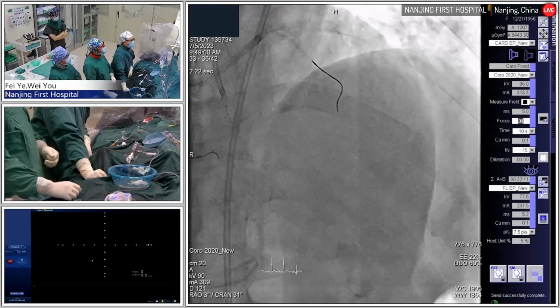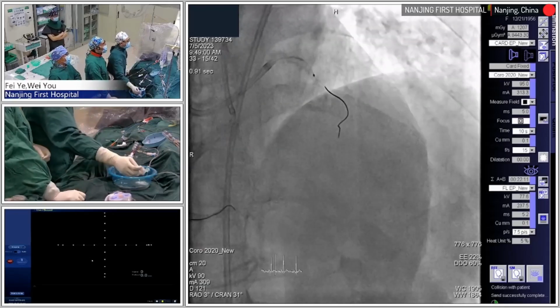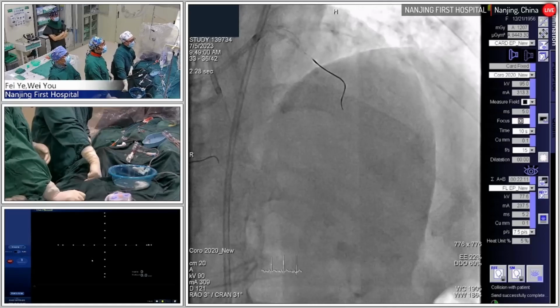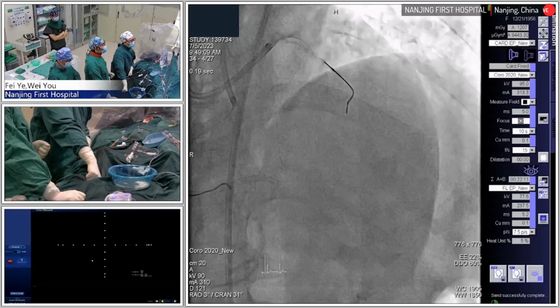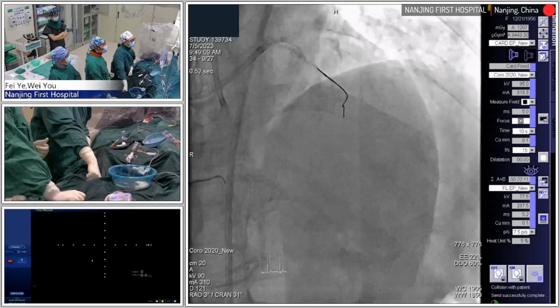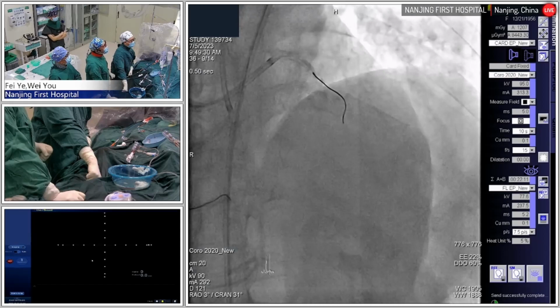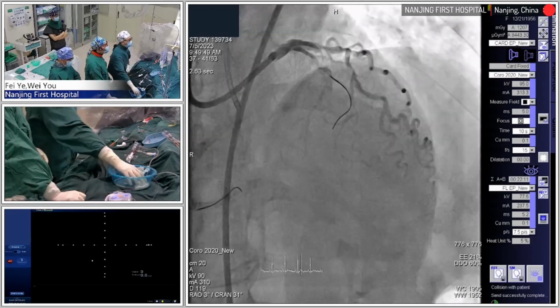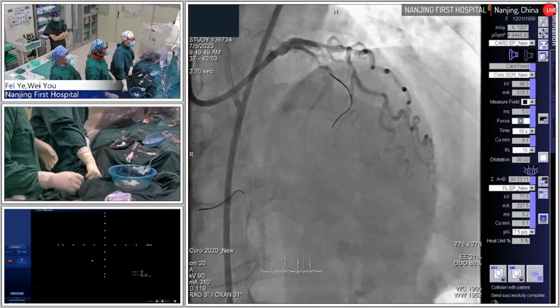Unfortunately, you can see the Finecross microcatheter just wanted to follow, but it did not succeed and cannot pass. The ostial lesion also has calcified plaque. So next, please. I used a 1.5 balloon to pre-dilate. Next, please. You can see the balloon did not expand well, and you can also see the contrast staining. It seems that the lesion is very tough.